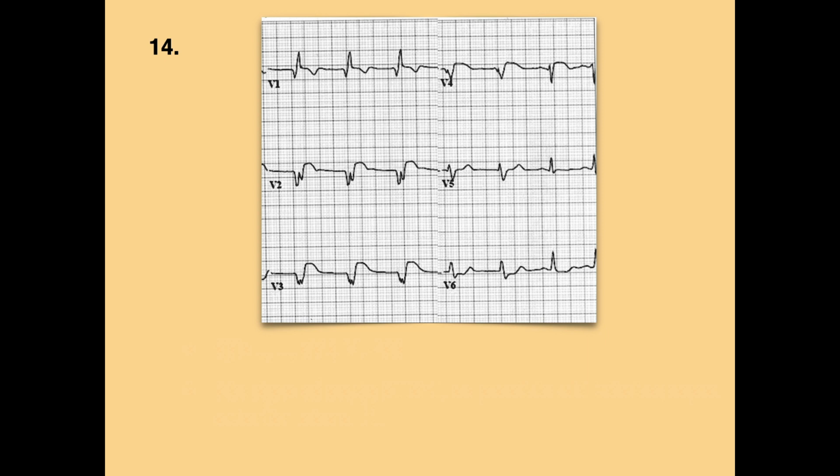And also, is that Q wave at least 2 small boxes deep? Yes. Pathologic Q. Okay. What about here? It's at least 2 small boxes deep. Yep. And then what about here? Yes. Okay. And then here, actually no, because if you look at the one good one, there is an R. RS. Okay. And same here.